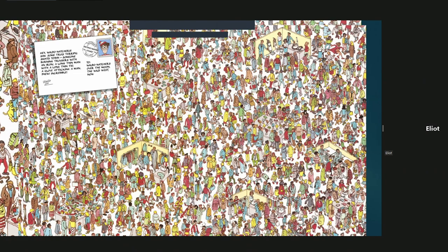And some of you may have already found Waldo. It's amazing how there are sort of Waldo cognoscenti. If we were writing a computer program to do that, we could identify each object and then run a series of queries and write an algorithm to do that. But with current approaches with convolutional neural networks, it's possible alternatively to train by example. Being able to take large numbers of images such as these, circle where Waldo is, and then have the computer learn by example without having to write code specifically to look for particular features, has allowed us to democratize and make it significantly faster to develop software that is able to perform a variety of different tasks.